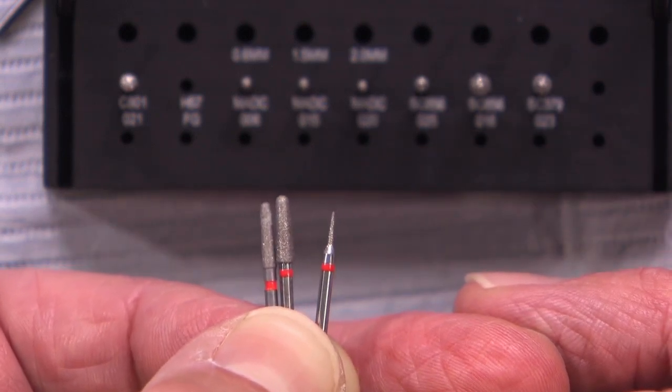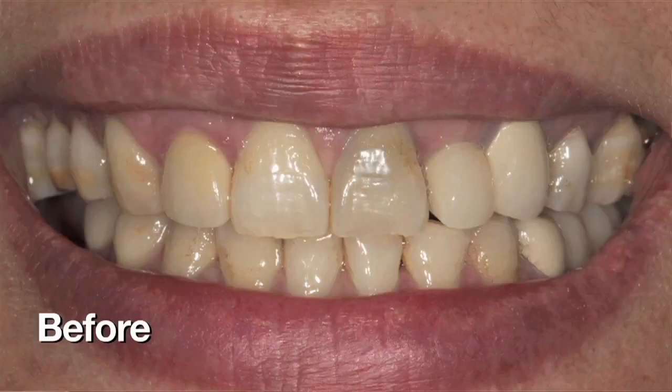So let's take a look at what this looks like clinically. This is a good clinical case to demonstrate the reverse preparation technique on, because it's a single anterior tooth that doesn't have a lot of previous restorations before, so we can stay true to the way the prep technique is meant to be done.